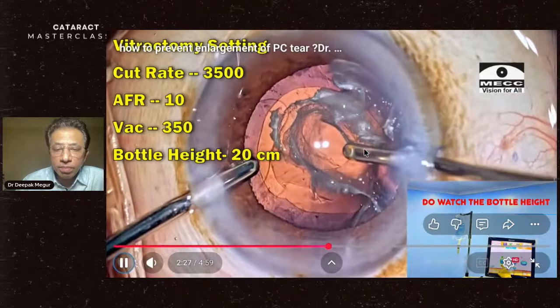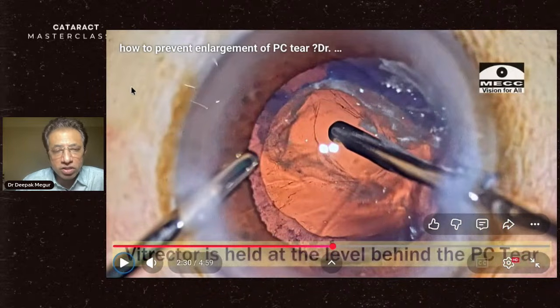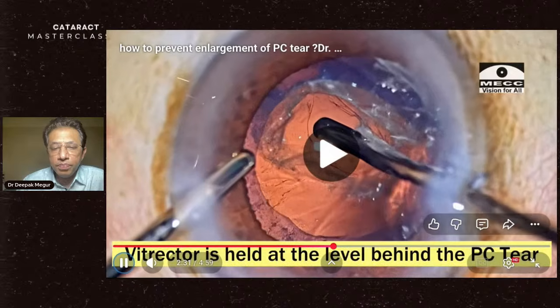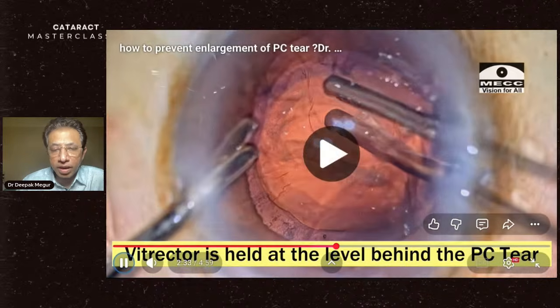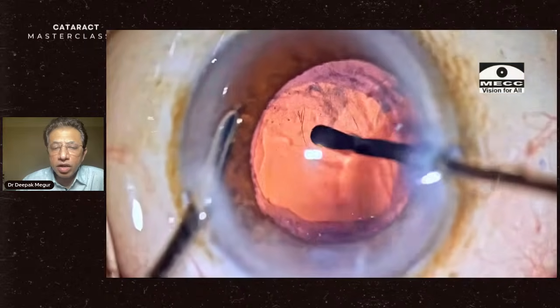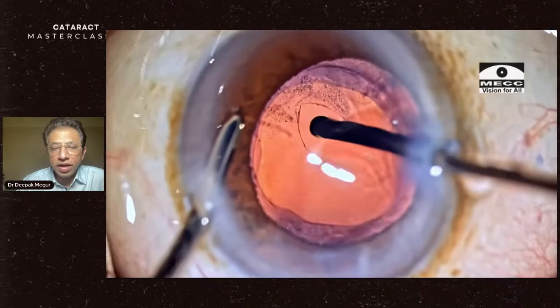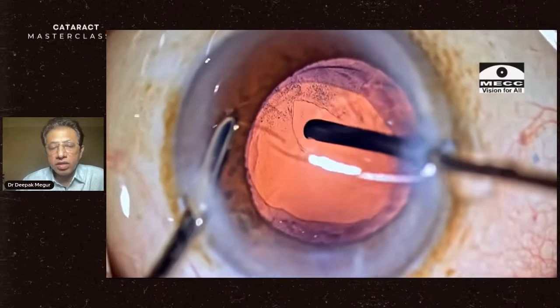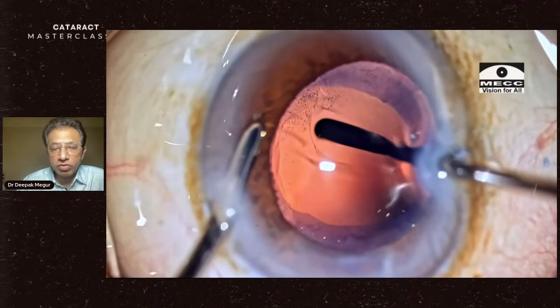Then after doing some cutting, the irrigation is introduced, because at that time you saw the bottle height was just kept at 20 centimeters. Now look at the position or the port angle. The port is facing posteriorly. It is placed behind the level of the posterior capsular tear, and then the cutting is started. You continue cutting until you realize that the vitreous around the posterior capsule is taken care of. Then you turn the bevel sideways and then anteriorly to take out the prolapsed vitreous anteriorly.